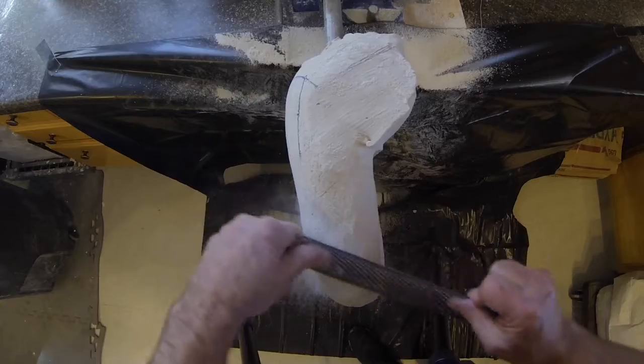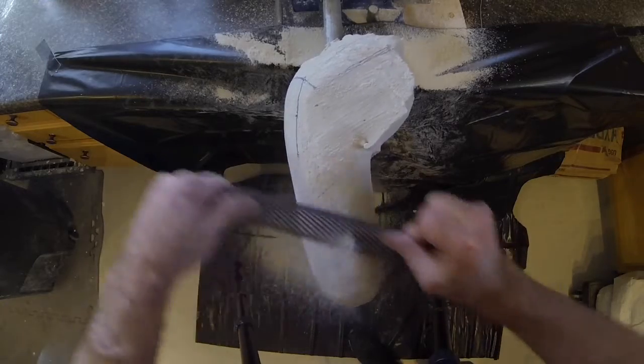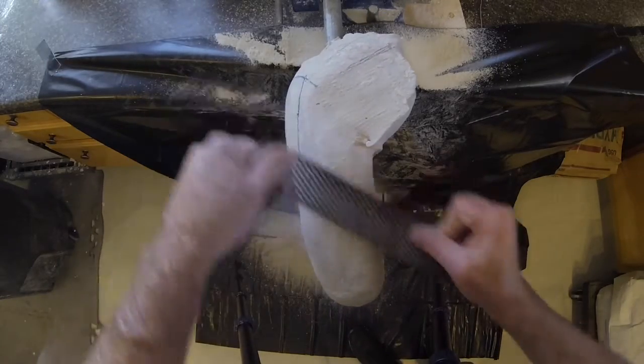Continue the global smoothing by following the general contours and removing high spots down to the low spots of the cast.